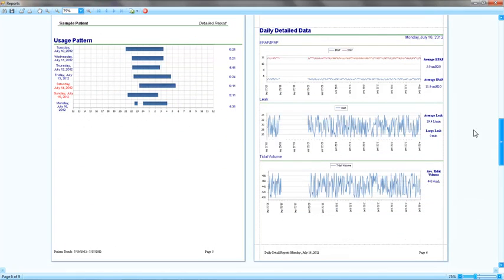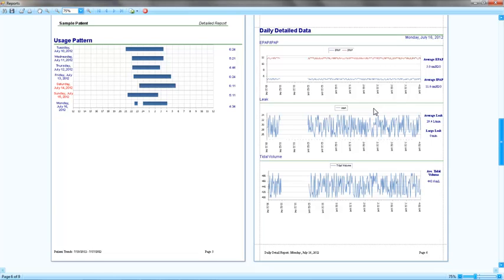And you will see the Daily Detail Charts for the selected days. In the Daily Details, you will see the following charts. 1. Nightly Pressure Chart. If the device is CPAP or Auto CPAP, you will see the pressures in the chart. If the device is a B-level device, you will see IPAP and EPAP separately. 2. Nightly Leak Figures. This will give you the leak flows for the night.